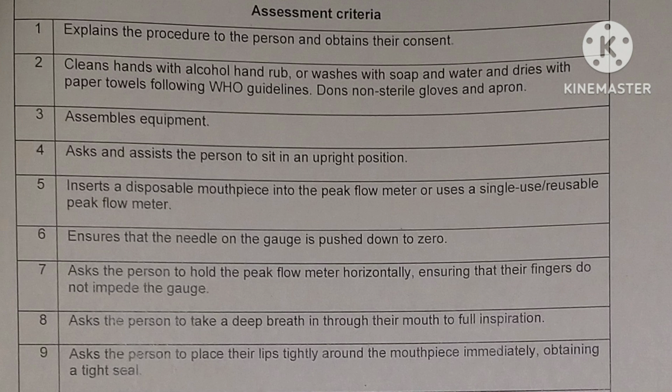We can ask them. Then we should inform them, first of all, I need to calculate your expected peak flow. For that, in the question there will be the age of the patient, so we should ask them. We can confirm again the age and height from the document, and we can calculate the expected peak expiratory flow rate.